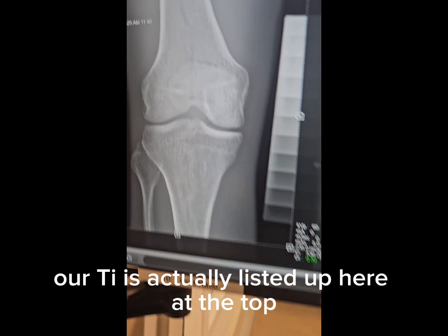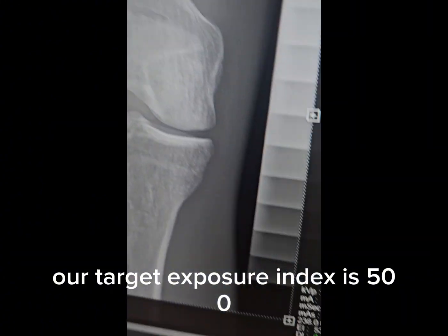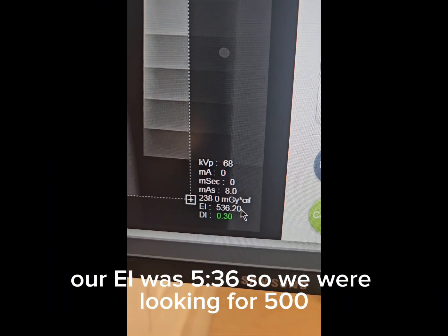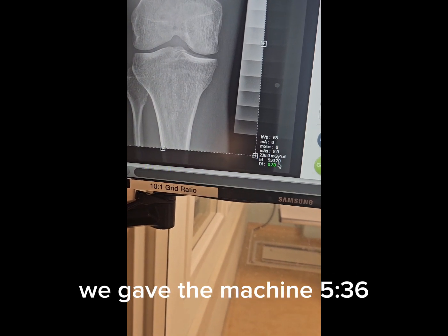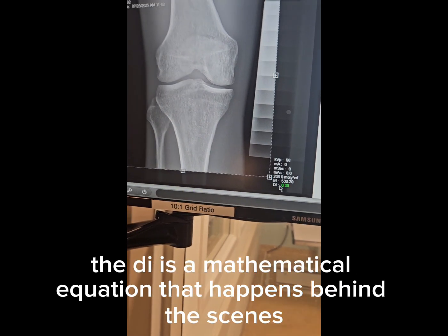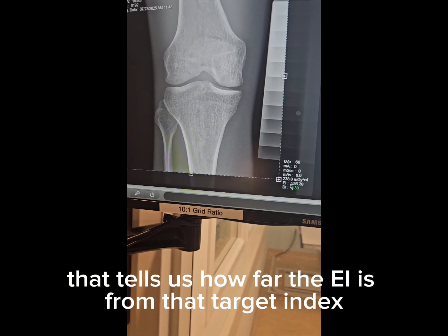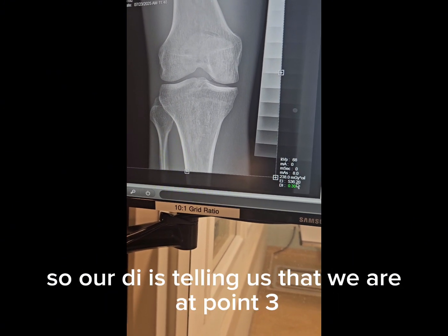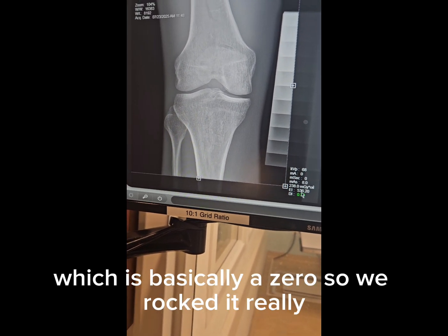Our TI is actually listed up here at the top. Our target exposure index is 500. Our EI was 536. So we were looking for 500. We gave the machine 536. The DI is a mathematical equation that happens behind the scenes that tells us how far the EI is from that target index. So our DI is telling us that we are at 0.3, which is basically a 0. So we rocked it, really.